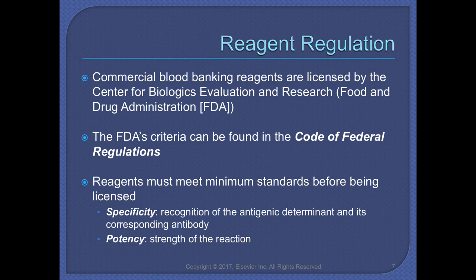Potency in blood bank reagents refers to the strength of the antigen antibody reactions, and specificity in the blood bank reagents refers to the recognition of the antigen and antibodies to make the antigen antibody reactions.